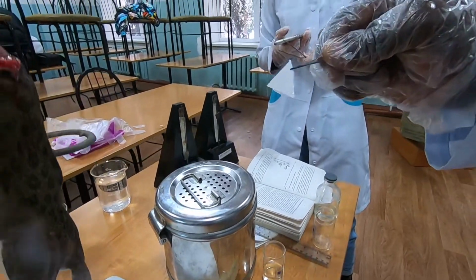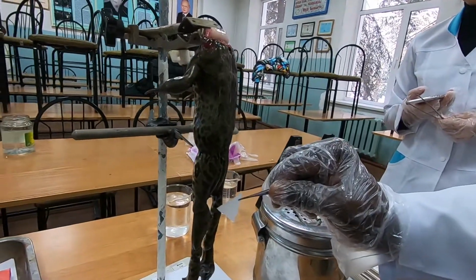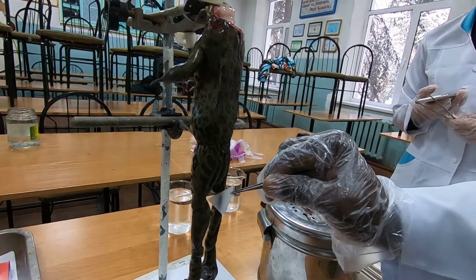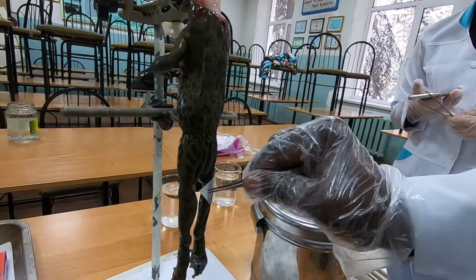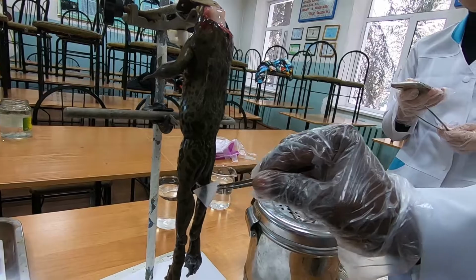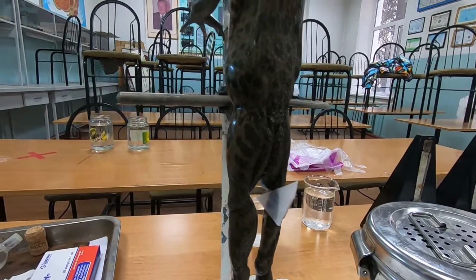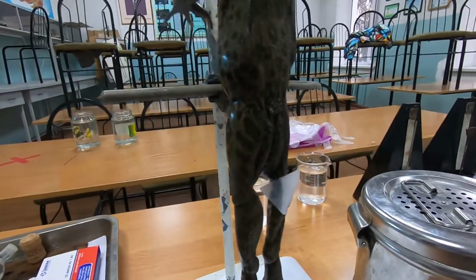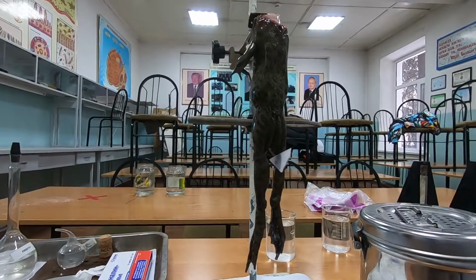Okay. So first of all, let's put it on the frog, and then let's see the reaction.